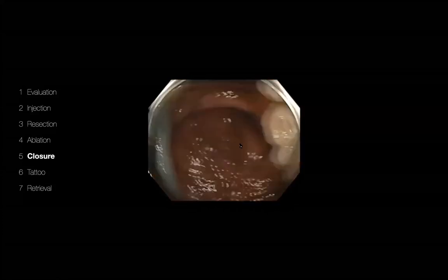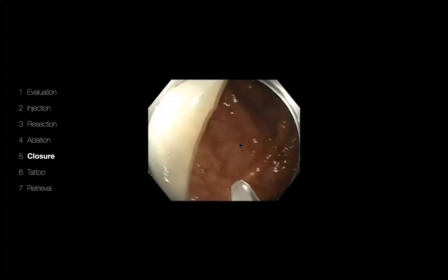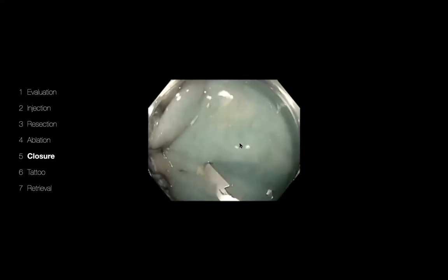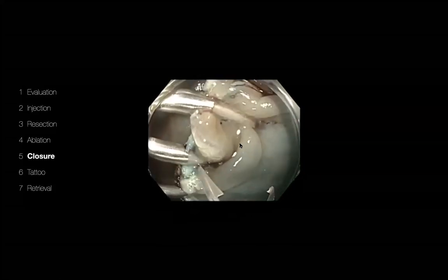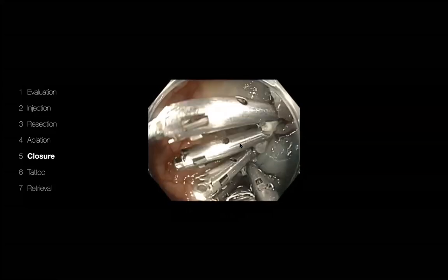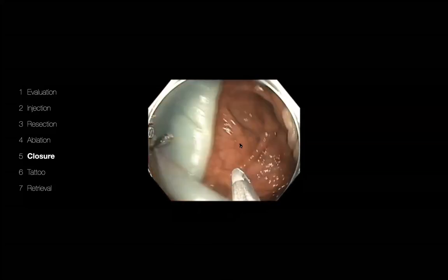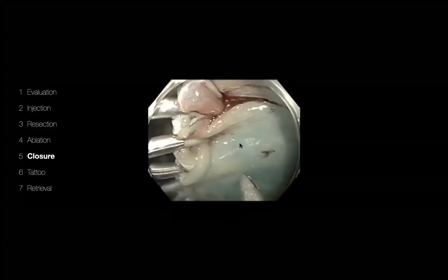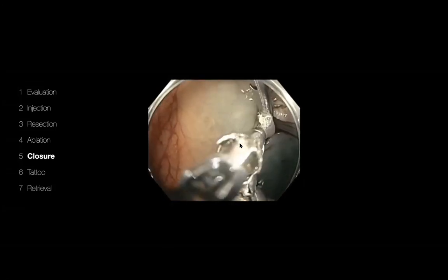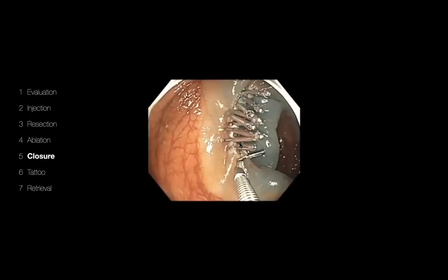If you schedule your colonoscopies for 30 minutes or 20 minutes, depending upon your practice, suddenly doing this large polyp resection would take a longer time. It took almost an hour for us to do this whole resection and complete the examination. It's also important, if you're doing resections like this, to reach out to the family and say, we found a large polyp, we're going to resect it and take care of it, so that people know what is happening. Because the risks of screening colonoscopy are different from the risks associated with a large polyp resection.